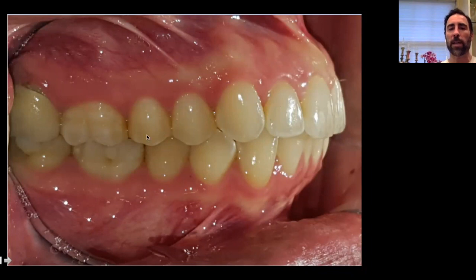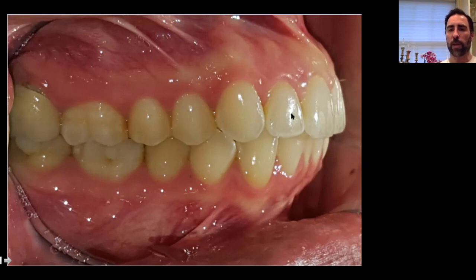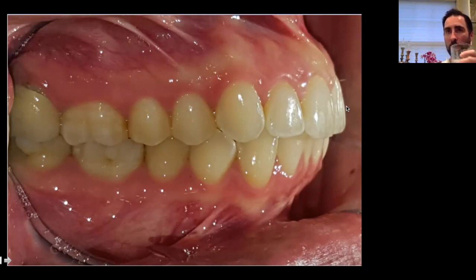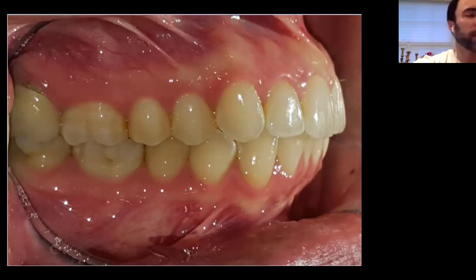The occlusal plane is centered right down the middle of the screen. The first molar and bicuspids are really 90 degrees to us. It demonstrates pretty good dryness. I captured most of my second molar, and I can see the contralateral central incisor. Seeing the contralateral central is really the key to knowing if you got a good lateral arch shot. If you can see the lateral or the cuspid on the side, you came too much from the front.